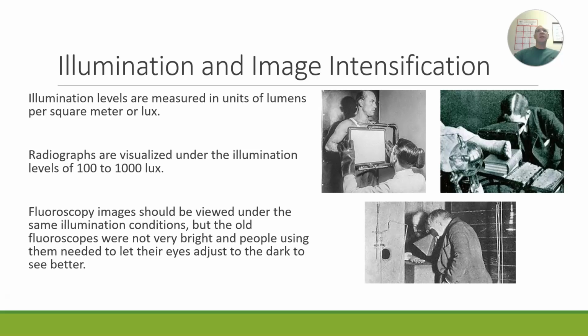And those cells, once they are stimulated, can pull out a lot better detail once they're adjusted to the dark. So back in the past, radiologists had to wait for their eyes to do just that. As you can imagine, this would slow the whole process down of patient care, and it takes a while for your eyes to adjust. So the thought was, is there any way to make these dim X-ray images brighter? And that's where the thought of image intensification came out. What we're trying to do is take the dim X-ray image and brighten it up, make it so bright that we don't have to wait for our eyes to adjust and we can see it right away.